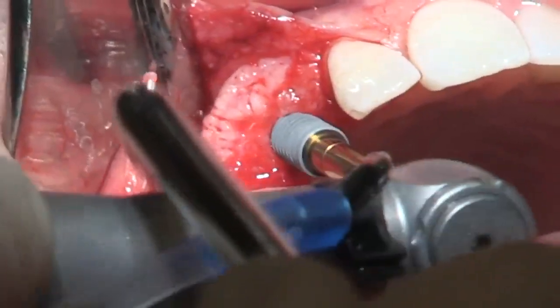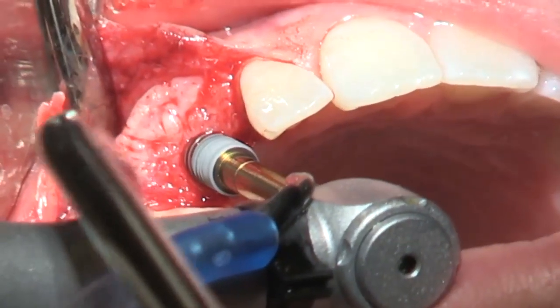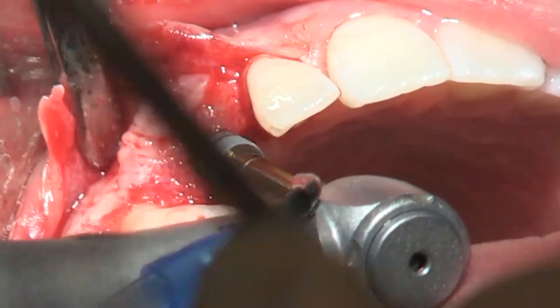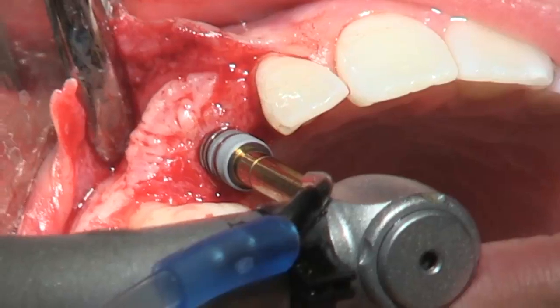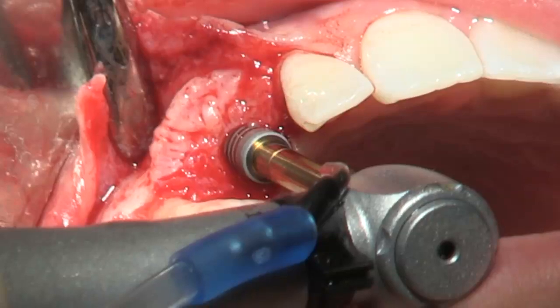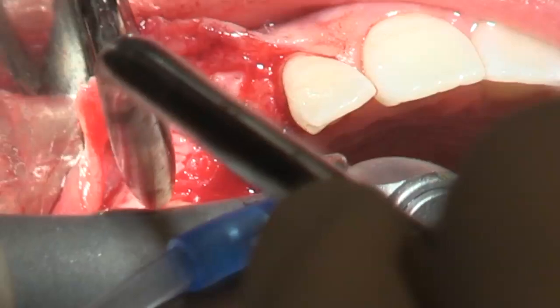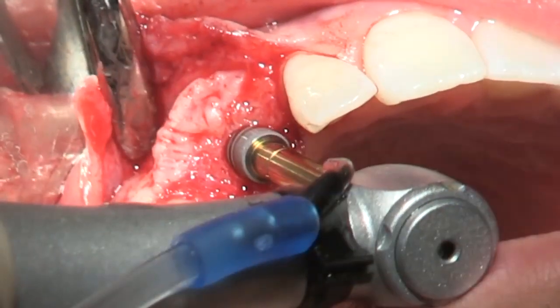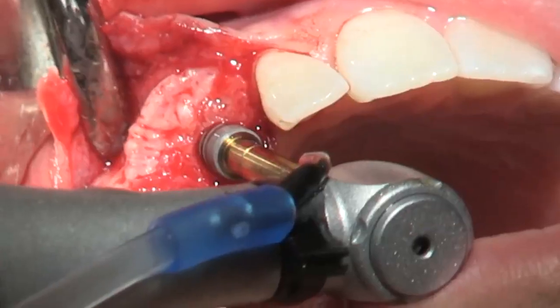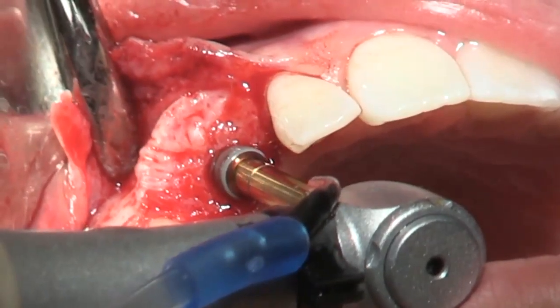At this moment, we're starting with a 20 Newton and allow the blood clot to have direct contact to the titanium surface, which is shown here in this view. Further insertion is continued. Then a slow reversal, and a second insertion torque of 30 Newton is being applied. Now we're at 30 Newton.